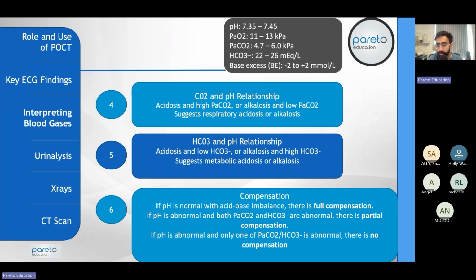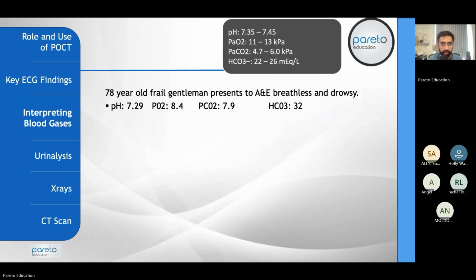So just a few examples. Well, one example really. A 78-year-old frail gentleman presents to A&E breathless and drowsy. How can we describe this ABG?